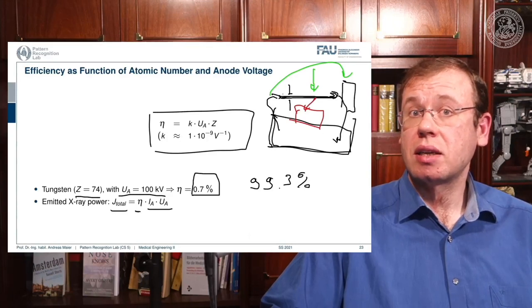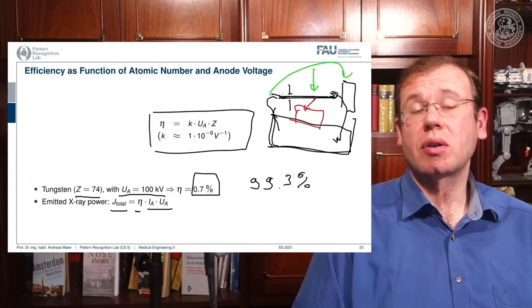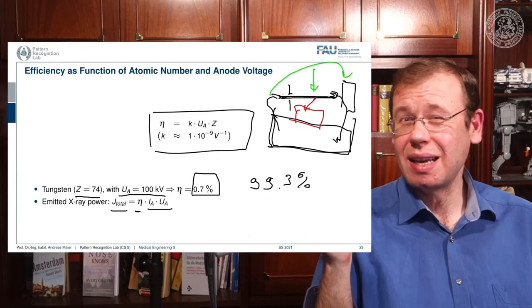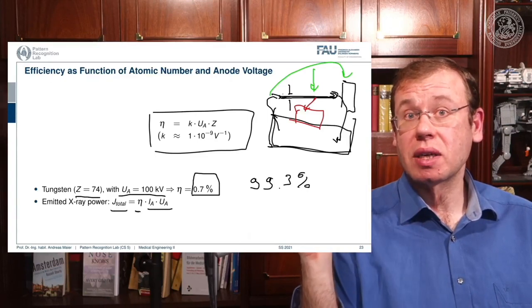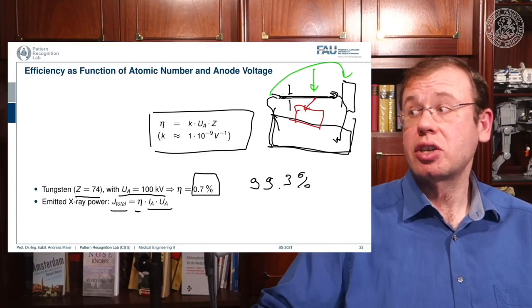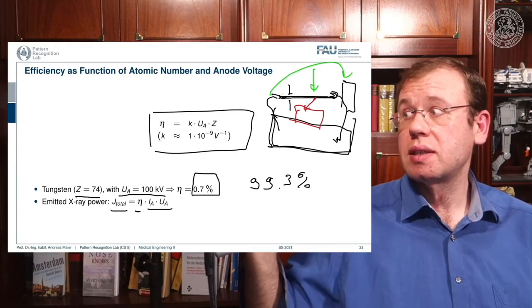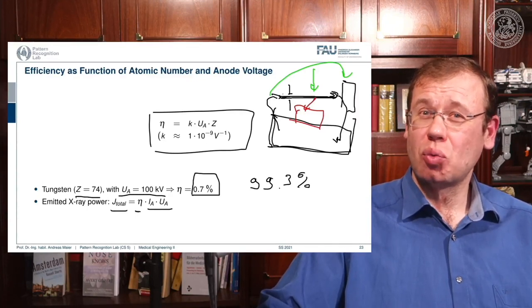You can use that in a stationary setting. So you set up the X-ray tube, and then if you want to scan something, you place it in front of it. And if you want to generate different view angles, you actually have to move the object. What you'll see later is that we also use CT gantries, and there we rotate very quickly about the patient. And obviously this kind of technology is very difficult because the inertial forces during the rotation would of course change the direction of our flow here. So things would be really complicated to actually install this on a rotating gantry. So current systems here use stationary liquid metal jet X-ray sources. But still, that's a super cool technology, isn't it?